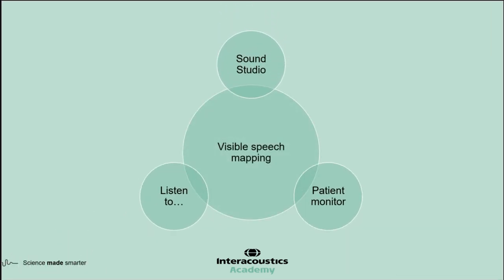So technology and counseling, as I say, I think they can go hand in hand. And I think there's been a lot of developments to make sure that technology does work for counseling. There's a few examples that I want to mention here. The sound studio is a fantastic way of setting up a speaker array so that you can demonstrate the real world in the clinic, developing that patient rapport and understanding the problems that they might encounter without them having to go away and try and report back. That is really great if you can have that set up.